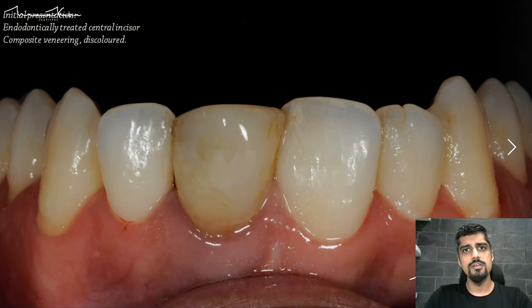This is our initial presentation — an endodontically treated single central incisor. There has been a composite veneering done about 7-8 years ago, and of course it is discolored. This discoloration is probably not only the composite that is discolored.